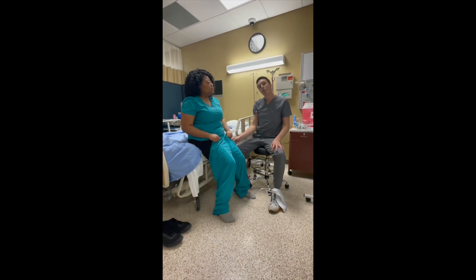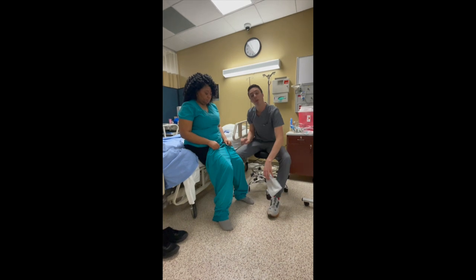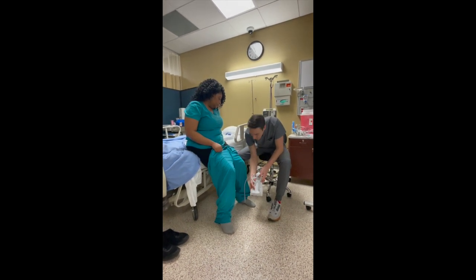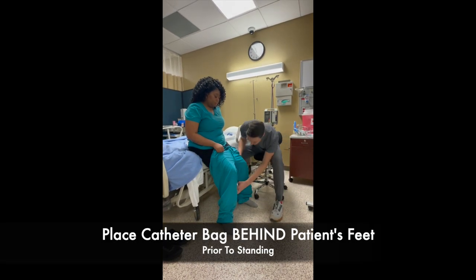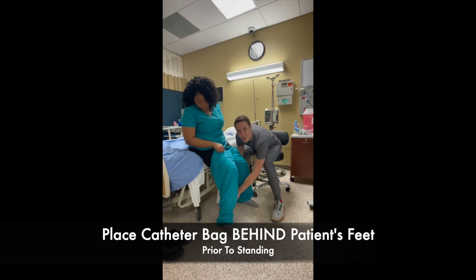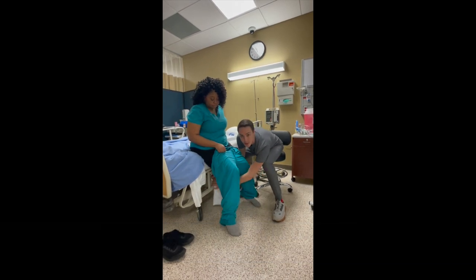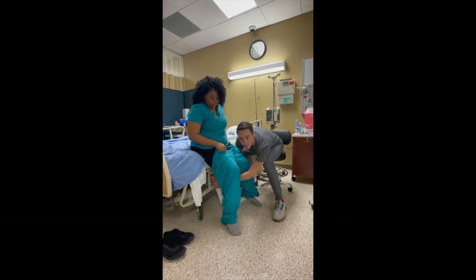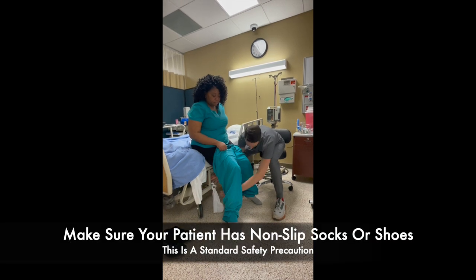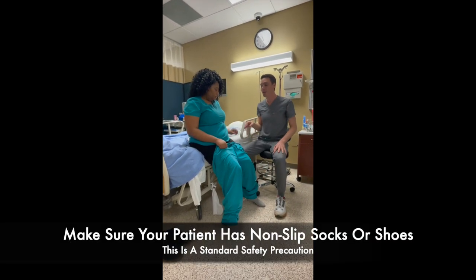Before the client stands up, you want to make sure you position the catheter bag behind the patient's feet so they don't step on it. There's typically a clip so you can clip it onto the bed behind them.